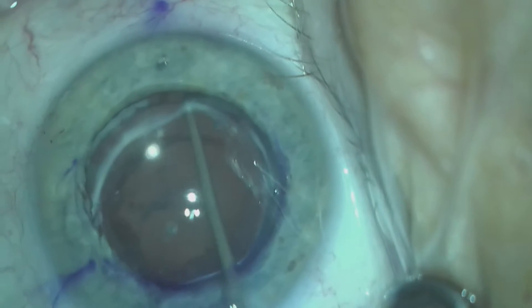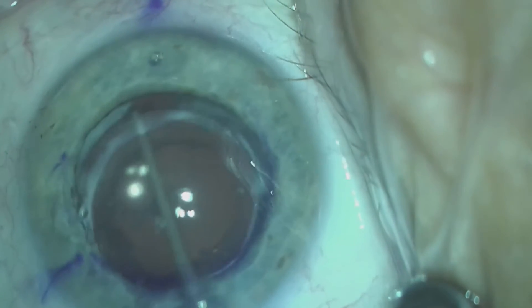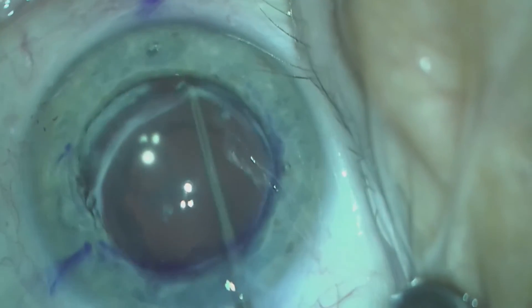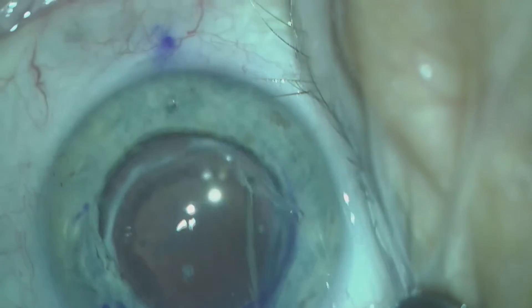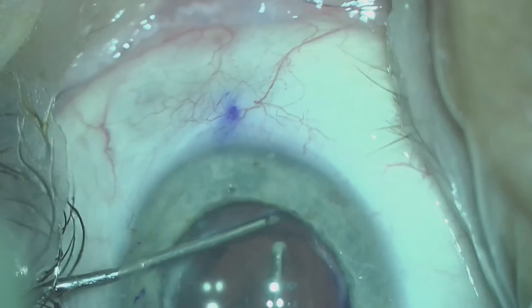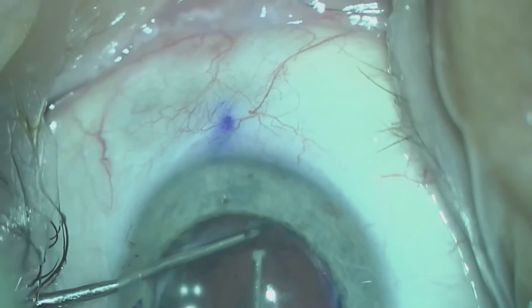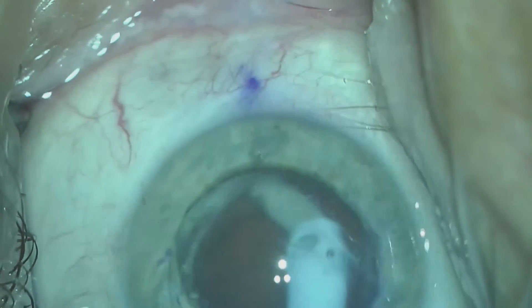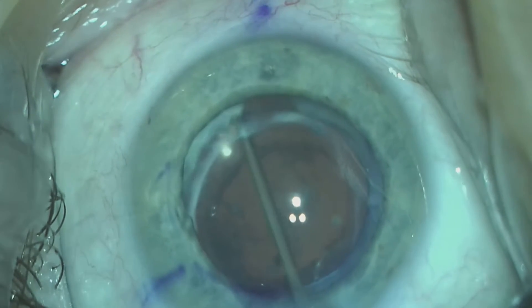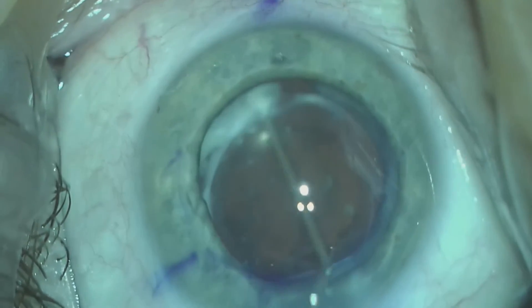A Sinski hook is then used to attempt to rotate the lens. However, due to the residual cortex left from the original surgery, it is firmly adherent and we are unable to complete this maneuver. The Donnenfeld LASIK flap elevator is then used to tent up the anterior capsule and we attempt to inject viscoelastic around the lens. In this process, we are able to free up some of the residual cortex where the haptic happens to be fibrosed in.